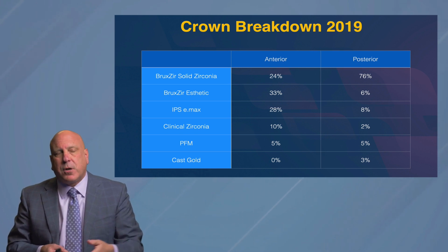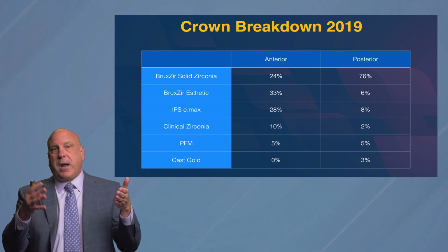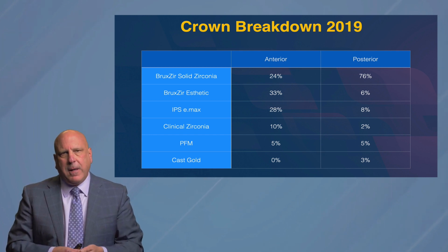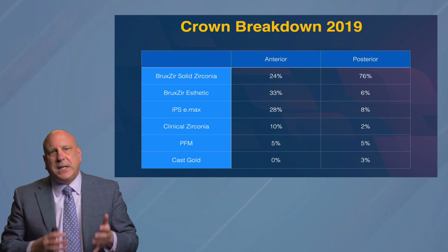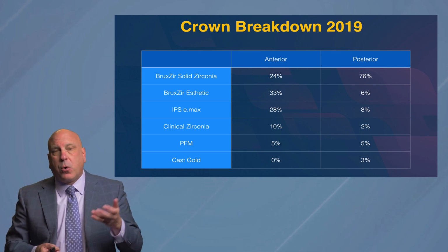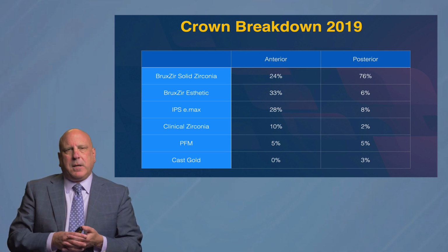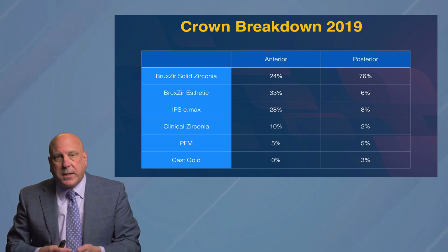And when we go deeper into zirconias in this module, we'll talk about that, but you can't get more translucency on a crown without giving up something. So we give up some flexural strength by going to the more translucent material, which is fine because it's for an anterior crown. But when we put those in the posterior, like these 6% of the crowns are, that's where we have an issue all of a sudden, because now we've seen in the CR studies that Gordon and Rella are doing on Emax and zirconia that these are the crowns that sometimes are breaking when dentists go to seat them.